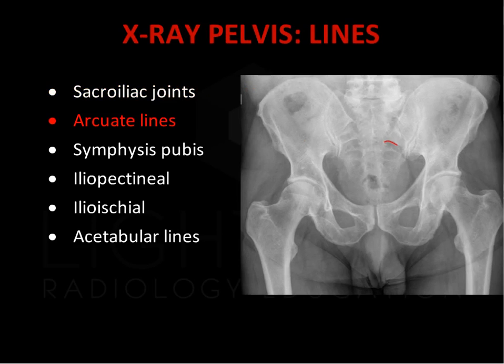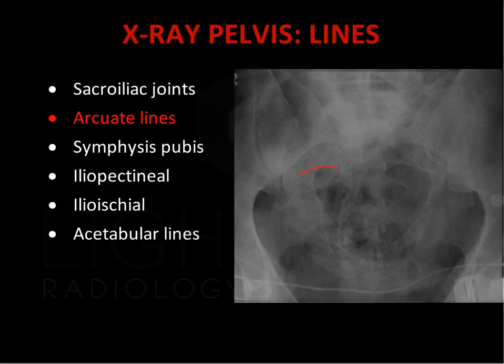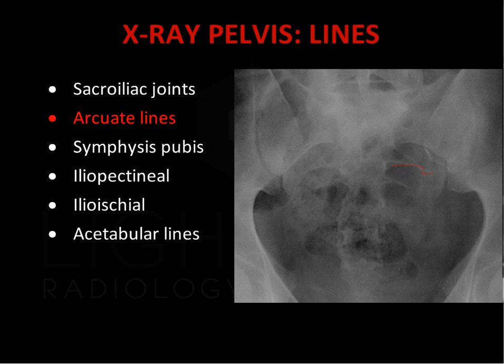The arcuate lines are formed by the cortical margins of the anterior sacral foramina. Asymmetry with disruption of the smooth arcuate lines is a sign of a sacral fracture.